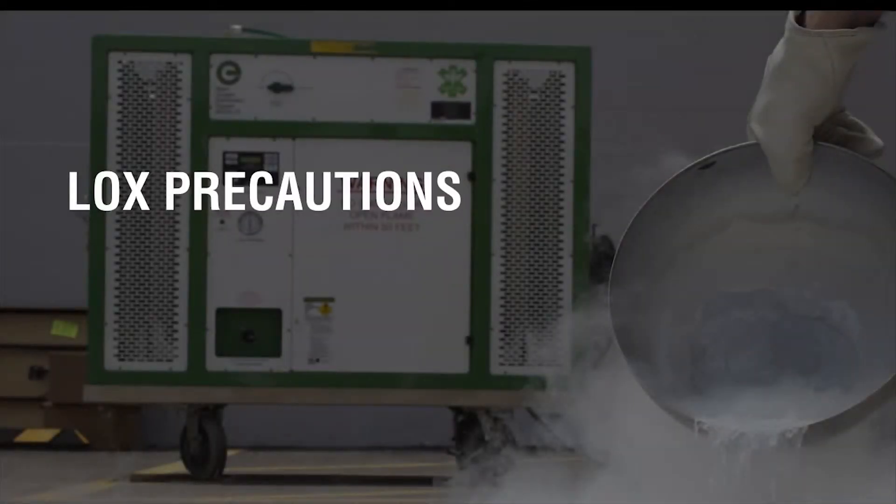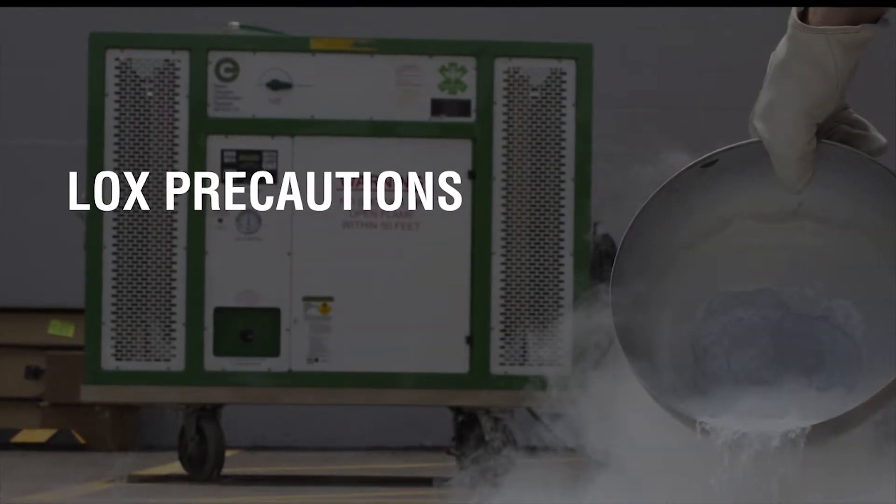Welcome to the MODS Filling Video. When using liquid oxygen, these precautions should be taken.